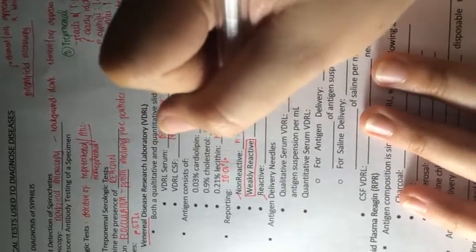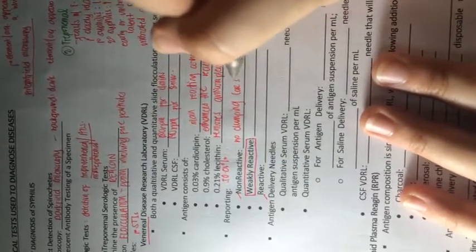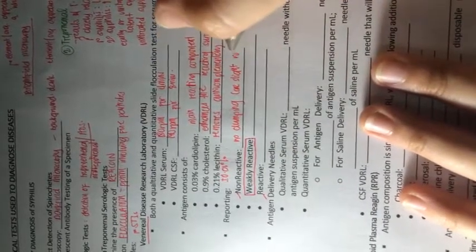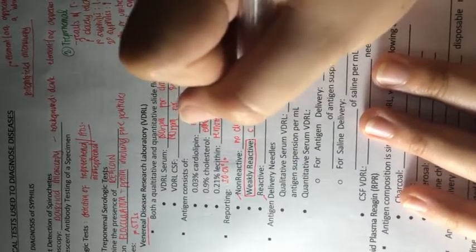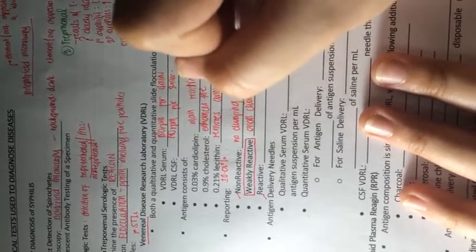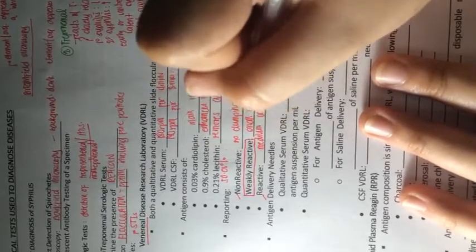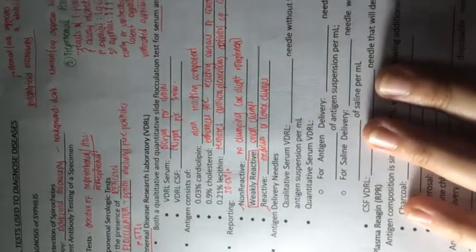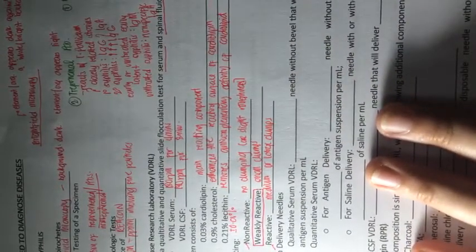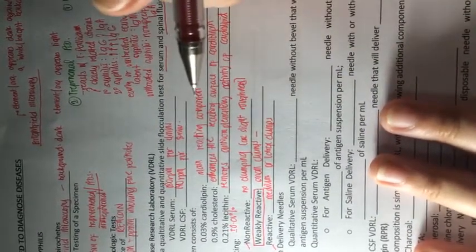When we say non-reactive, there should be no clumping, or only slight roughness observed under the microscope. When we say weakly reactive, we can see small clumps, and reactive is characterized by medium or large clumps. Like what I said, since we do not report weakly reactive, what should we do if we see small clumps and, based on our decision, it is weakly reactive? So neither positive nor negative.